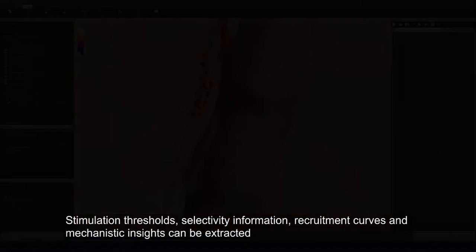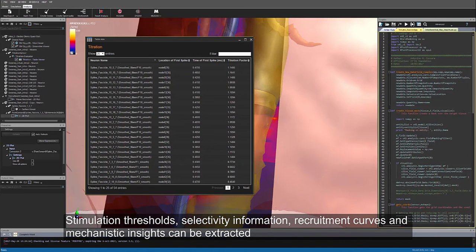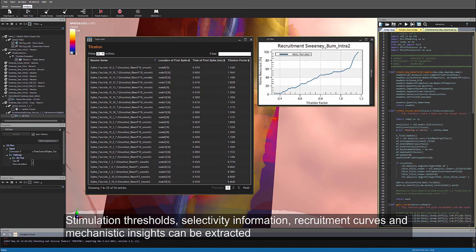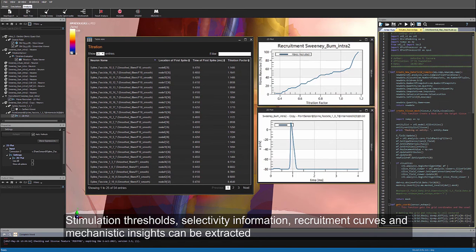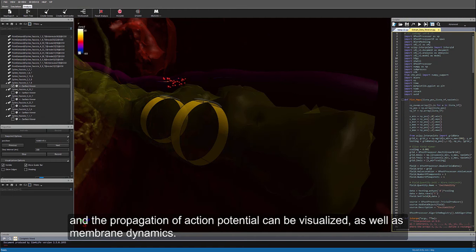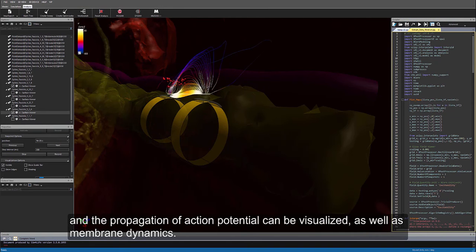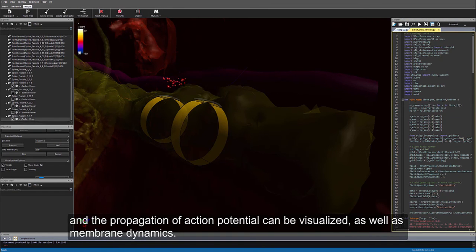Stimulation thresholds, selectivity information, recruitment curves, and mechanistic insights can be extracted, and the propagation of action potential can be visualized as well as membrane dynamics.